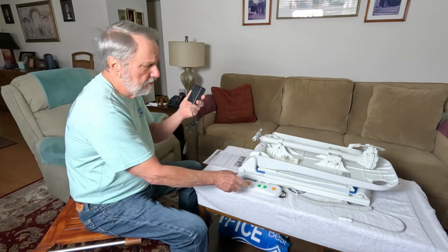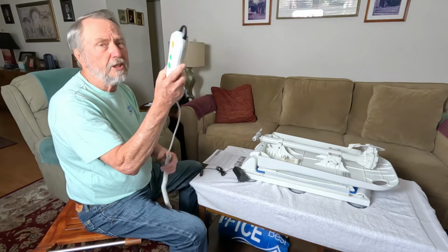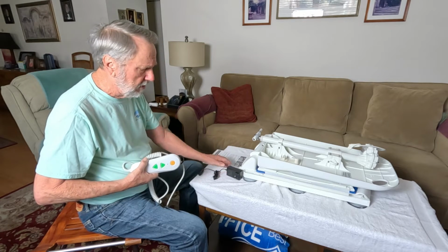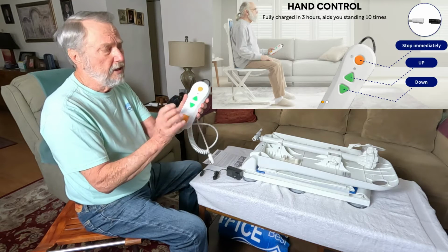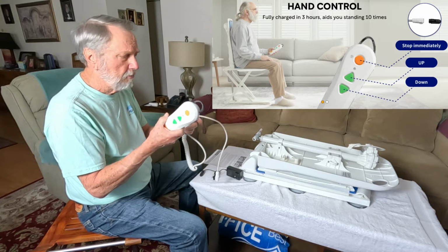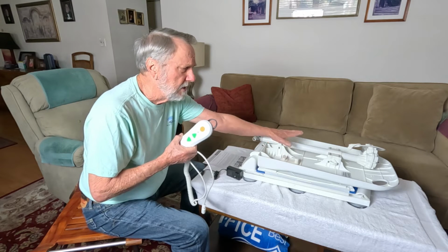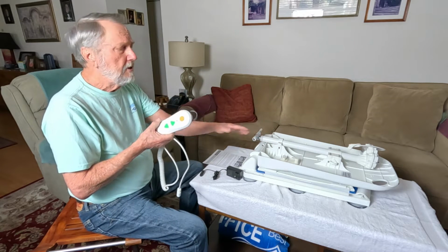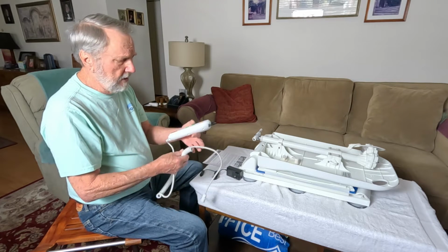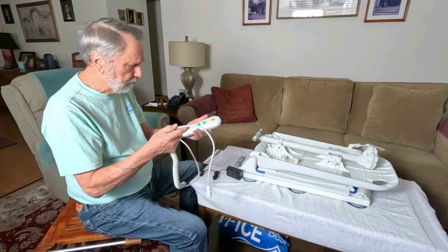You also get a battery charger, and the battery charger has a little light right here. When it's plugged in to the controller, it will be red, and when the controller is charged up, it will turn green. So this is how you charge up your battery, in this controller, and it's a wired controller. It's not a wireless controller. There are no batteries or any electrical in the chair itself. So that's why it's waterproof and can go in the water in a tub. This cannot. This is not waterproof to be inside the tub.